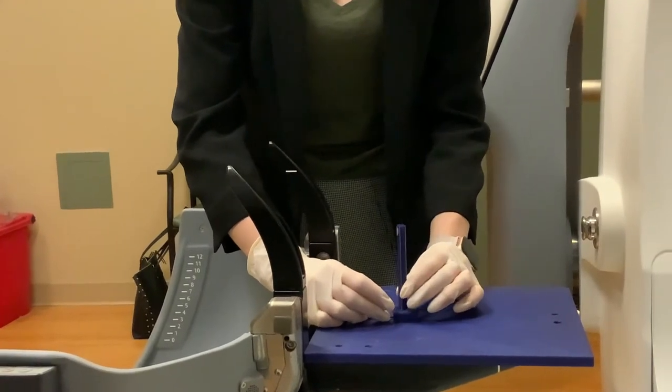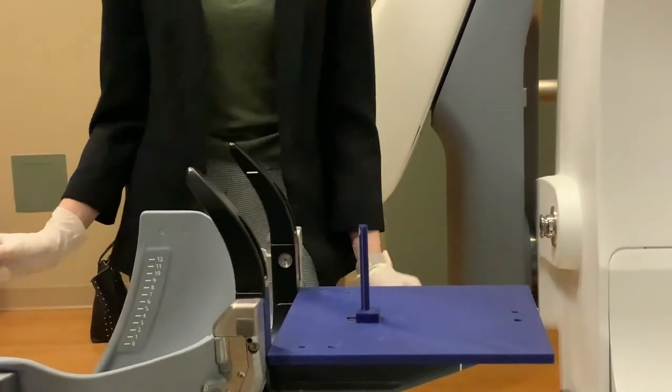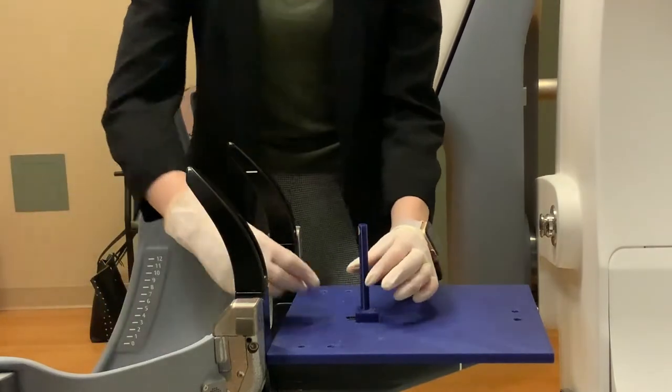In practice, the procedure takes less than a minute to set up and confirm 1mm shifts for the X, Y, and Z directions.